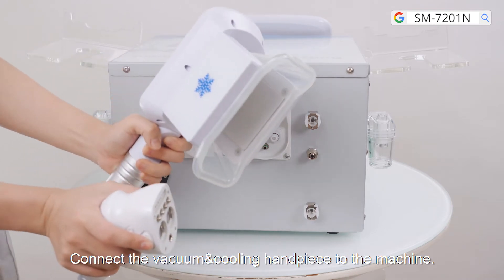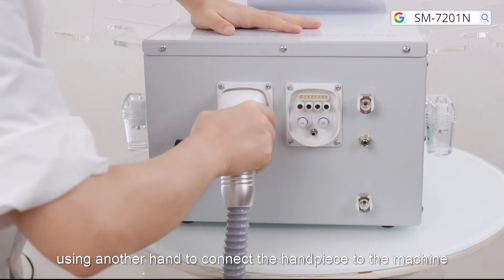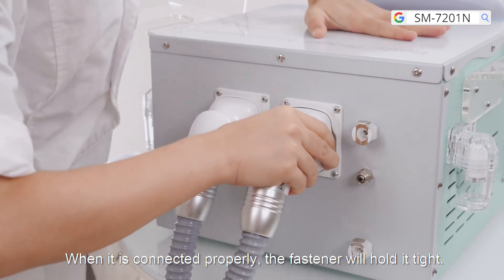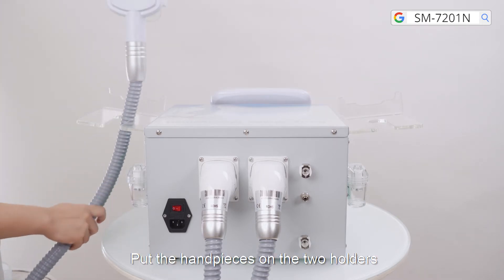Connect the vacuum and cooling handpiece to the machine. You need to press the fastener with one hand while using another hand to connect the handpiece to the machine by aligning it with the small holes. When it is connected properly, the fastener will hold it tight. Put the handpiece on the two holders.